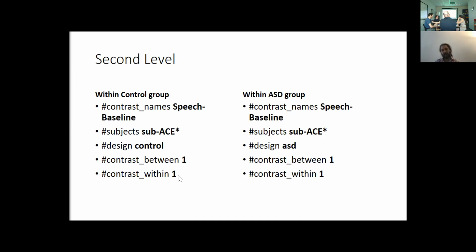Right, and those subjects that you are removing, are you removing them directly by entering missing values in the control and patient covariates, or how are you removing them? So they're in my TSV file from just having all of them in there, but they have NAs for all of their values. Okay, fantastic. So I don't want them pulled in for anything. I just want to document them in there. Okay, everything looks perfect then. So then these are my within group.